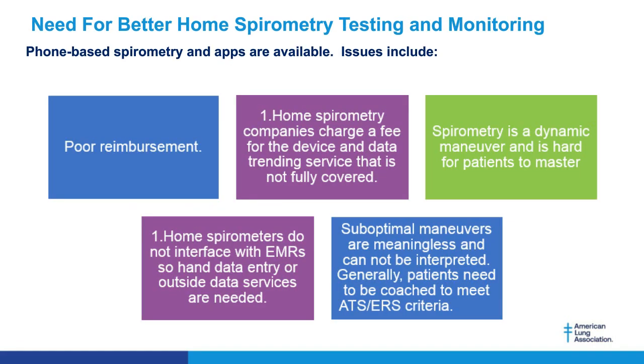Both the American Thoracic Society and the European Respiratory Society suggest that we start thinking about home-based spirometry and monitoring. And so we have a big committee at the University of Minnesota where we're looking at home-based spirometry for our lung transplant patients and also for our cystic fibrosis patients. The Cystic Fibrosis Foundation has given us 40 home-based spirometers to give to our cystic fibrosis population, and we're trying to decide who best could use these type of devices.